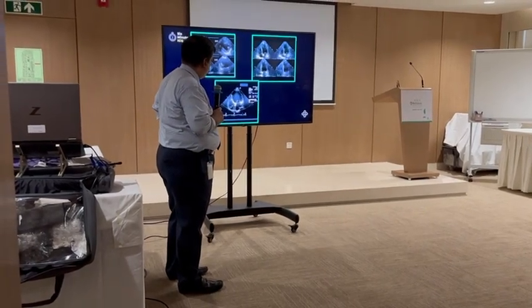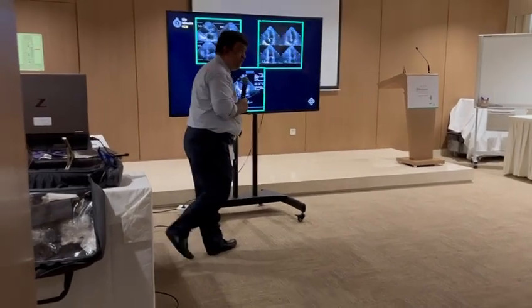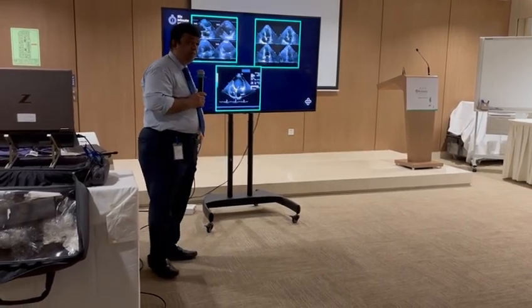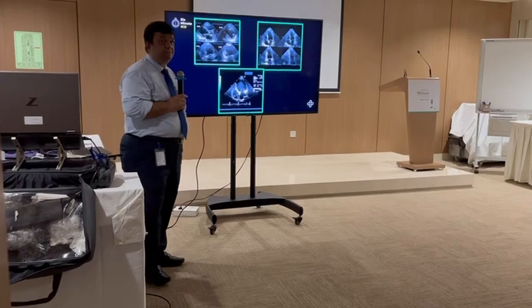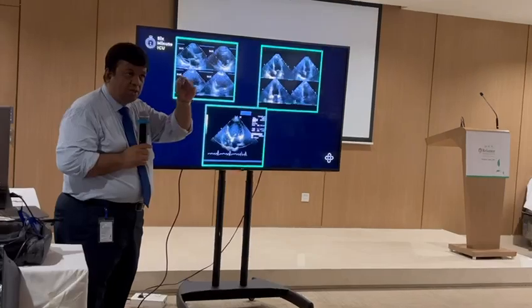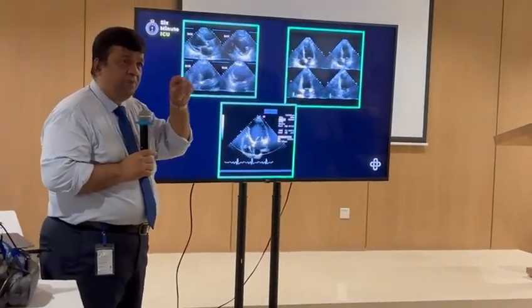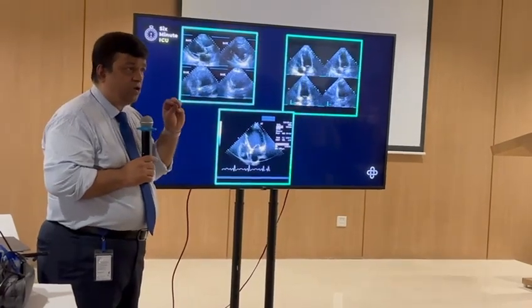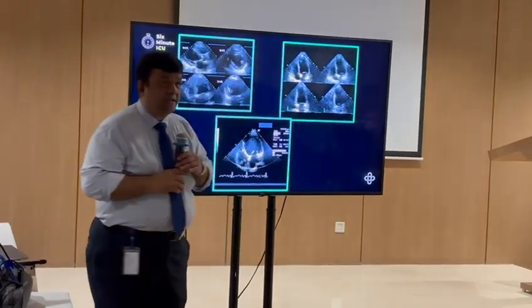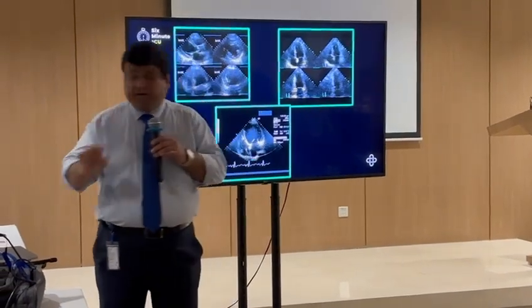Okay, so the right ventricle seems to be collapsing. Doesn't seem to be fluid there, at least from this view. But I don't want you to concentrate on the right ventricle, I want you to concentrate on the left ventricle. Tell me something inside the left ventricle. Echoes we can see. Spontaneous echoes. So you can see some cigarette smoke. What we call as spontaneous echo contrast. Now spontaneous echo contrast is swirling of the blood because of poor left ventricular contractility, giving this smoky appearance within the left ventricle. Okay, that's the sure shot sign of severe LV dysfunction. That means the blood is not getting pumped out easily.